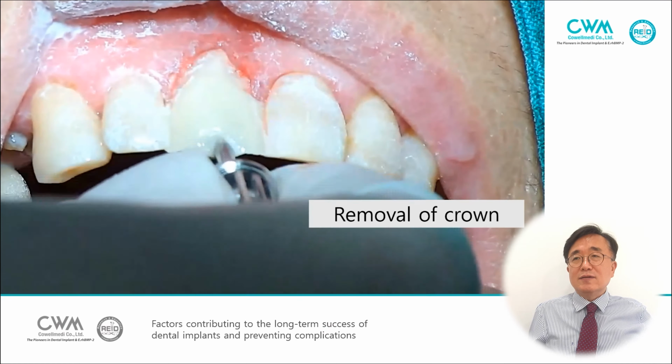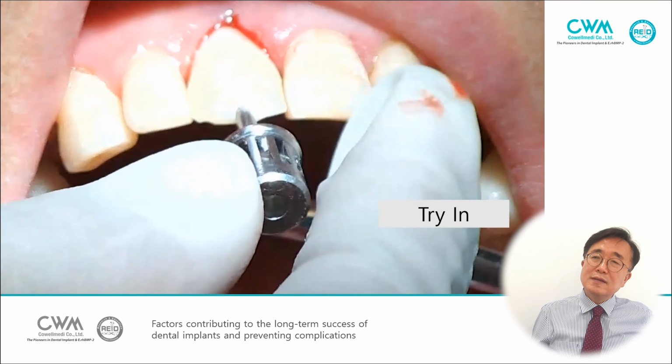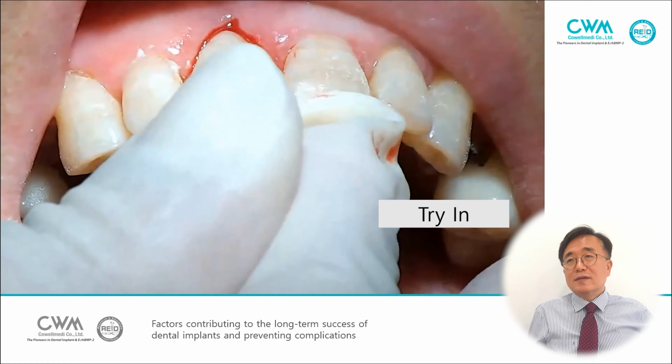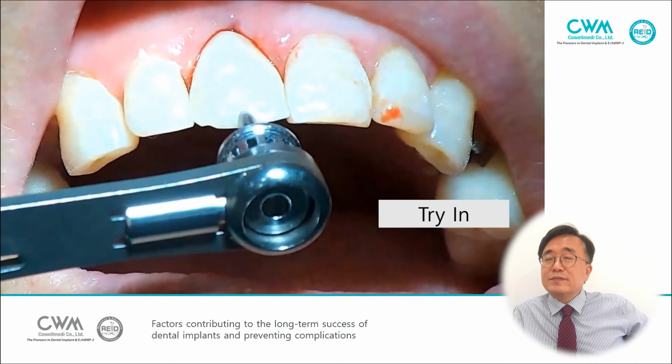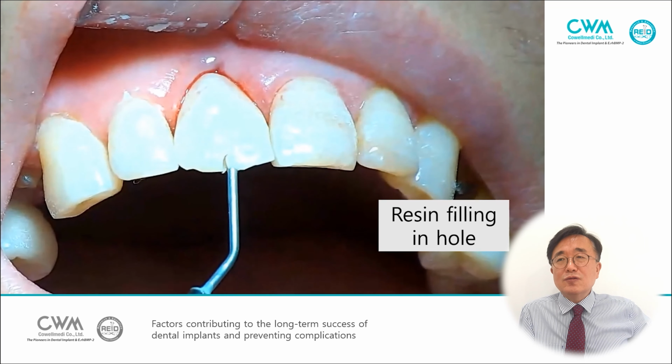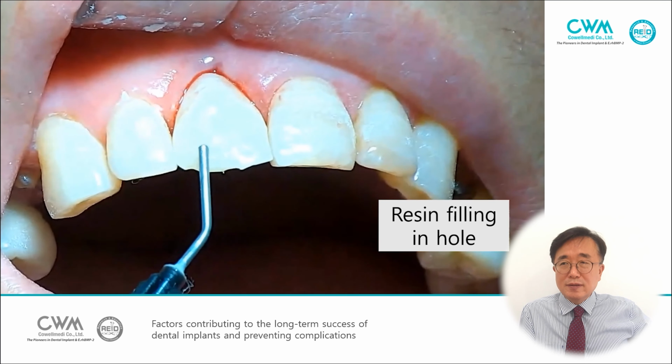Cervical resin filling, and then inserted, trying. A customized emergence profile and provisional restoration is made. And then the screw hole is filled with resin.